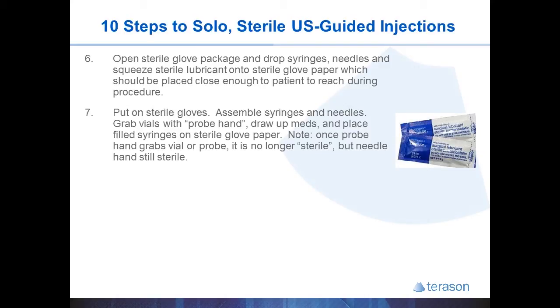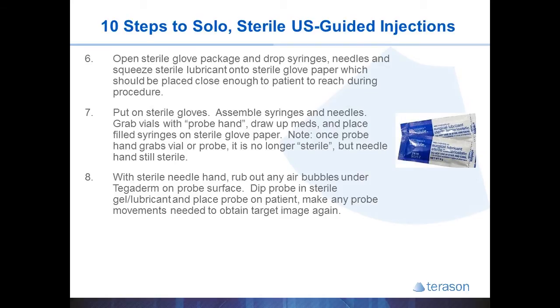Use your probe hand to grab the vials of medicines, while the other hand controlling the syringes remains sterile. Using the sterile needle hand, rub out any air bubbles that might be underneath the Tegaderm. Any air bubbles will block the ultrasound image and cause very poor image quality during your procedure, so it's an important step to remember. Then dip the probe in sterile gel and place the probe on the patient.